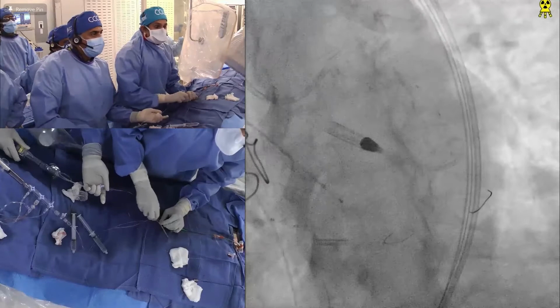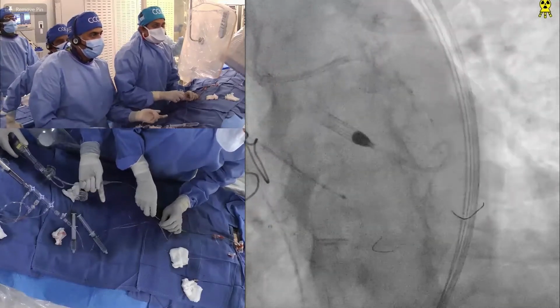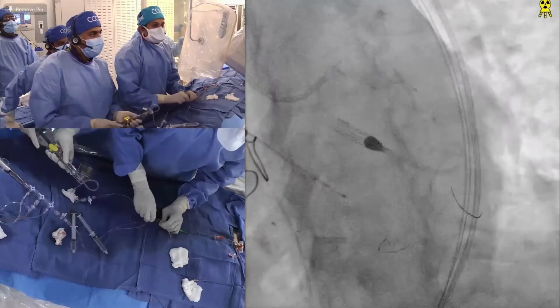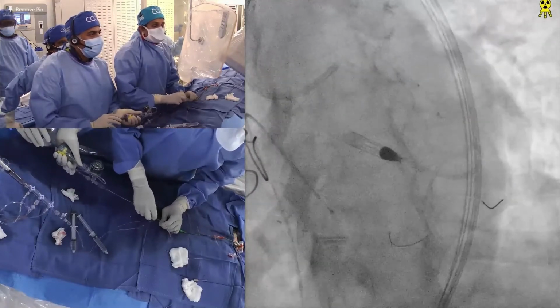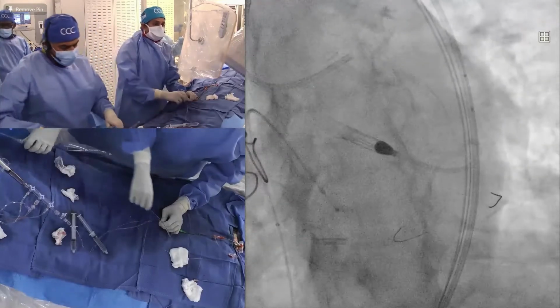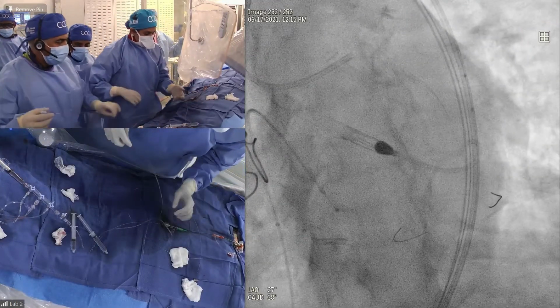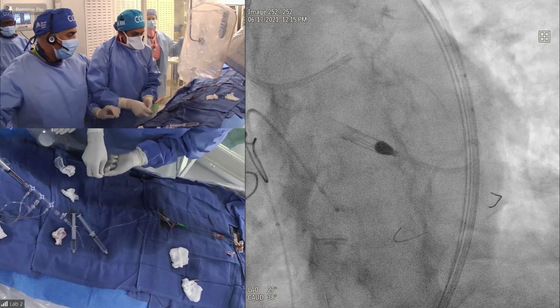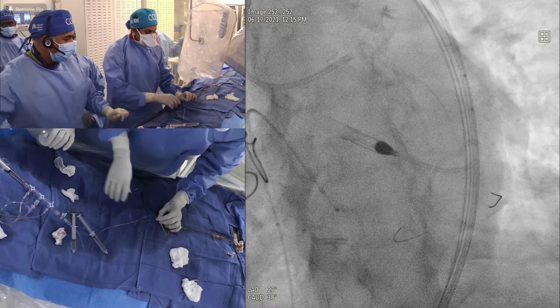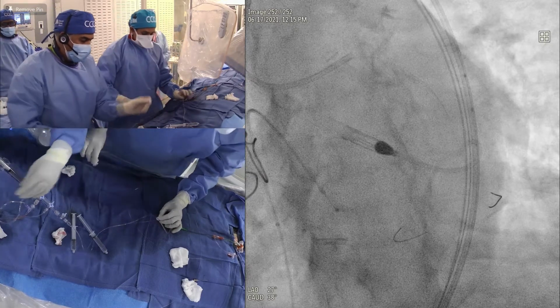Despite the 1.25 balloon, yeah, we need to go back to that. Have a compliant balloon. Get a 2 compliant balloon. 2 by 12 compliant. Do you want to do that or go with the guideliner? No, 2 compliant. Okay. We are going to go with a 2 compliant balloon. So we're hearing, you can go to the guideliner too, to extend the guide and help deliver that bigger balloon, but they feel like with a non-compliant, they can get to it.